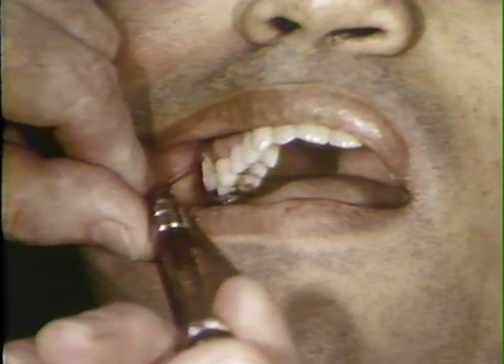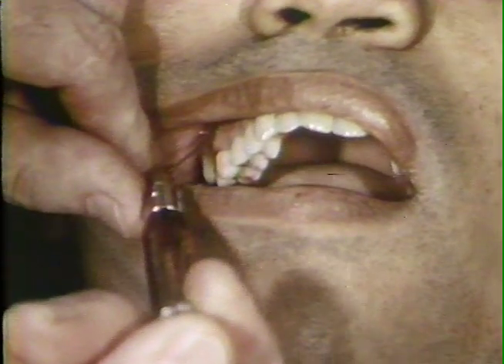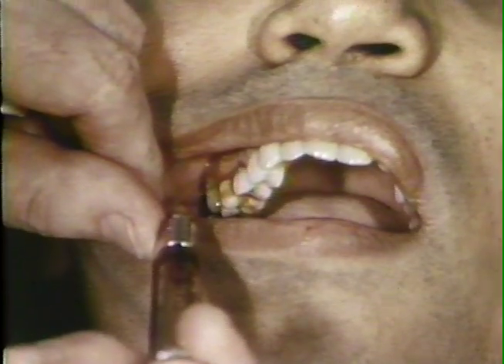The field of operation is flooded with iodine lotion, which also is deposited in the periodontal pockets with a blunt needle syringe. Excess iodine is absorbed with a sponge.